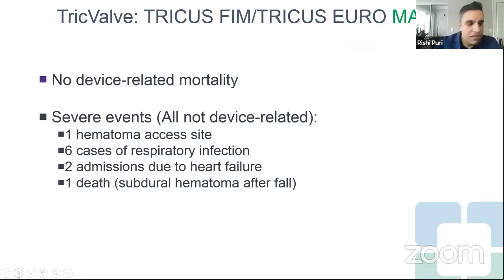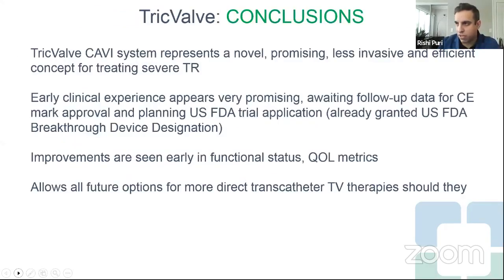From the major adverse cardiovascular events perspective, thus far, there's been no device-related mortality, which is important. There's been a hematoma at the access site, remembering this is a large bore venous access. We've had some patients with respiratory infections. There have been patients that have been readmitted with heart failure. And there was one unfortunate patient that fell and had a subdural hematoma, but these do not appear to be device-related, and these early data are encouraging.